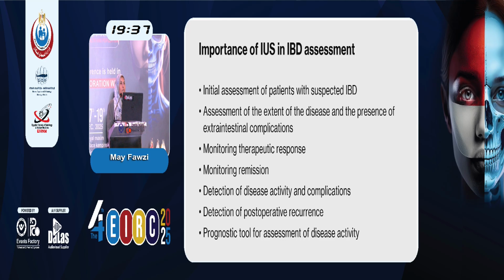So according to the ECCO-ESGAR guidelines, the most recent, IUS can be used for the initial assessment of patients suspected to have IBD, assess the extent of the disease and the presence of extraintestinal manifestations and complications, monitor therapeutic response, monitor remission, and allow patients to be de-escalated from treatment, detect disease activity and complications, detect post-operative recurrence, and it can be used as a prognostic tool for the assessment of disease activity.